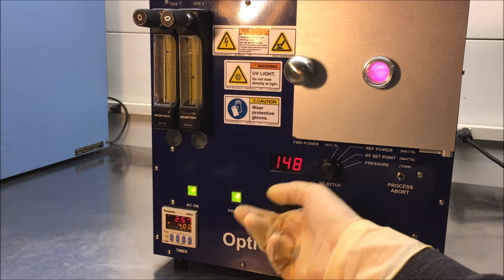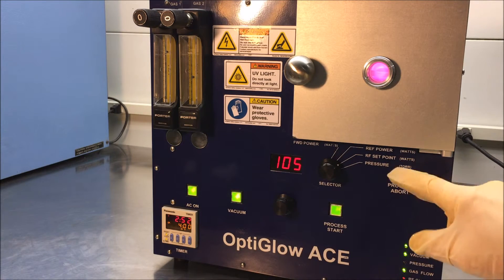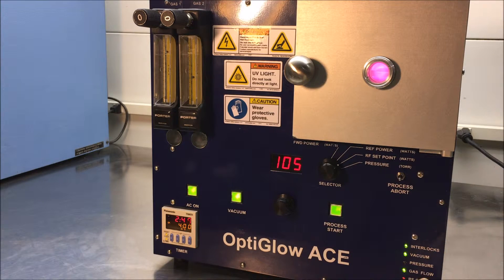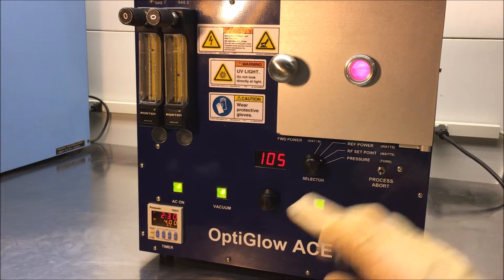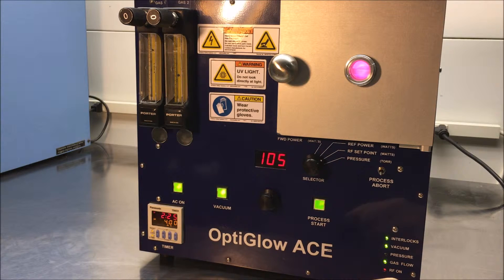You can adjust your power over here — you can adjust it up to 150 watts or it can strike a plasma as low as 10 watts. You can stop the process by hitting the process abort, which we'll do in just a moment. Right here we have LED indicator lights that tell you about the interlocks, the vacuum, the pressure, the gas flow, and the RF on. Glow Research makes the entire system from the chamber to the RF generator to the matching network. The matching network is an automatic tuning matching network and it tunes extremely well.